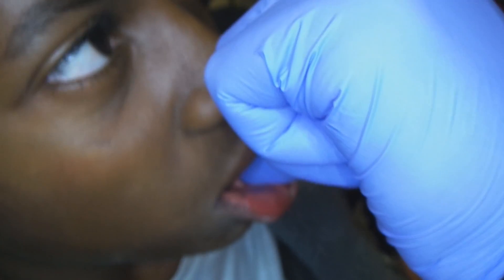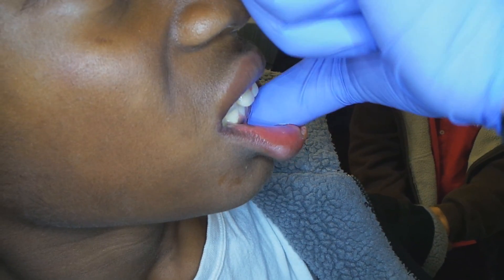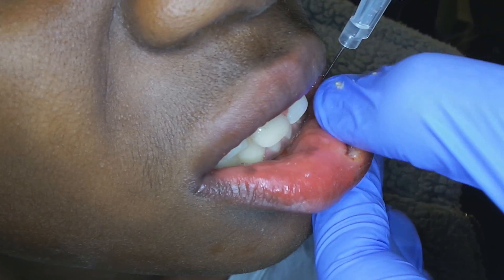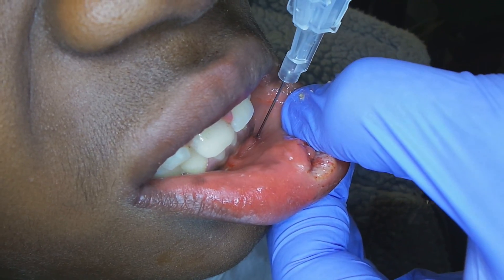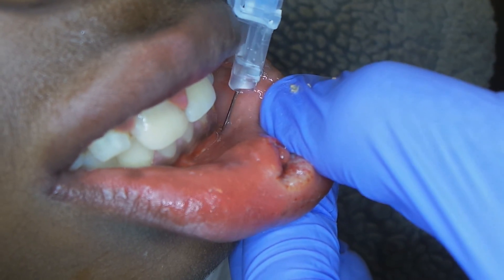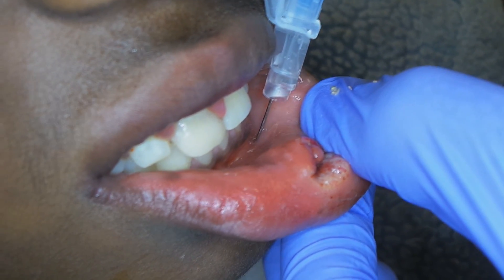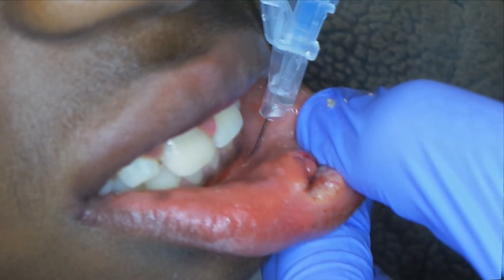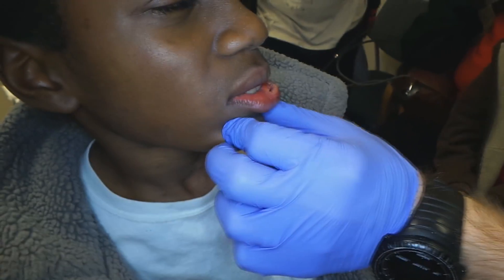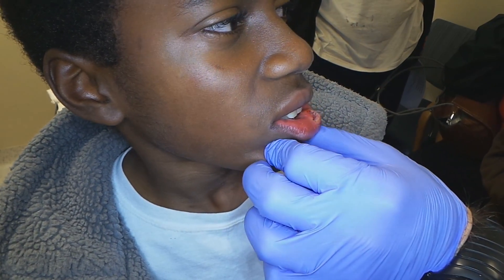I'm going to relocate it. There it is — right under his canine on this side. I'm going to pull back and poke in, right over the foramen. I'm going to do a little withdrawal to make sure I'm not in the artery or vein, and put in about one to two cc's. Then we'll just massage it in. I can feel the wheal right over there.